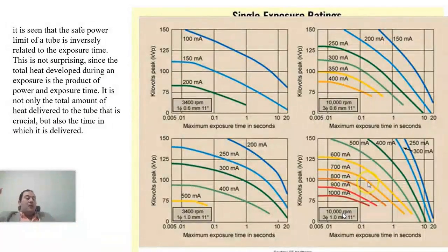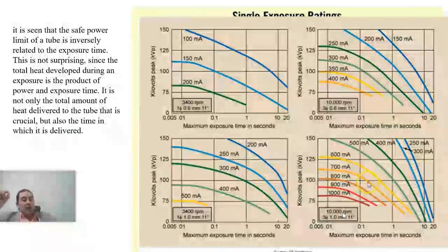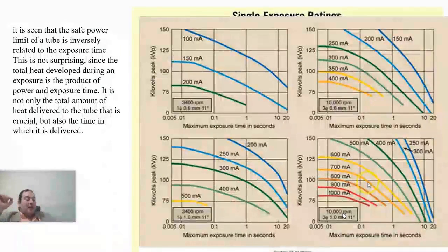When I work, it's not just about kV and milliampere. I can significantly reduce the time of exposure by increasing table speed or decreasing rotation time, which results in a shorter scan time, leading to a lower patient dose compared to other methods. However, this is not absolute. It depends on the type of exam and the version you are working on.